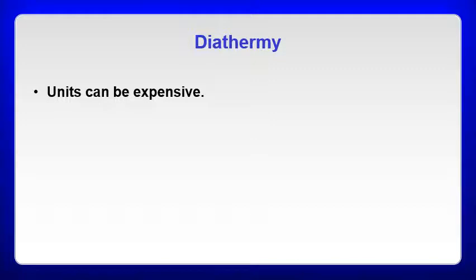Okay, so the reason why you probably don't see diathermy getting used a whole lot is the units can be expensive. Now, more and more over the past couple of years, they've come out with some different ways to apply diathermy, so the cost has come down quite a bit, but that certainly has been one of the things. Even in clinics, they tend not to have them because of the cost of the unit and the number of treatments you'd have to do to recoup that cost. Sometimes clinicians don't see the benefit of that.